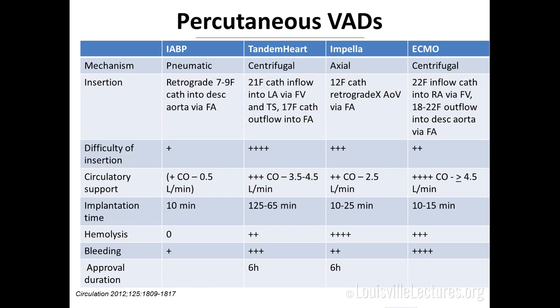So all of these things have to be inserted into the vasculature. And depending upon where you are and what the local expertise is and who is responsible for putting these things in, that often dictates the choice of what you end up doing. So in my training, we never put in Impella devices. Here at Jewish Hospital, that's probably our go-to for mechanical circulatory support. So it really depends a lot upon who you have and what's available to you. But I want you to know about what they are a little bit.